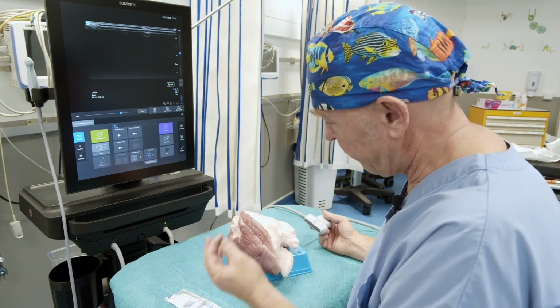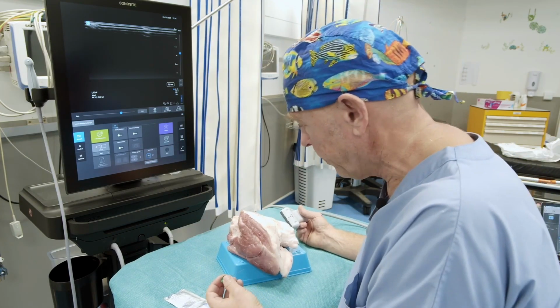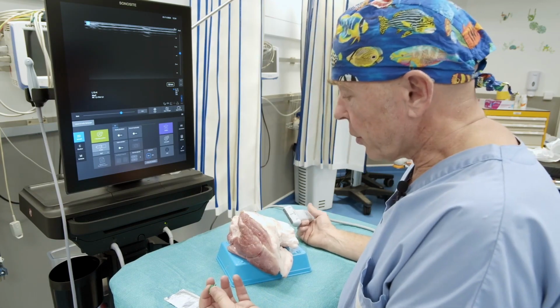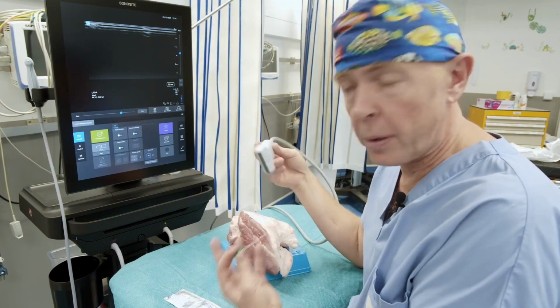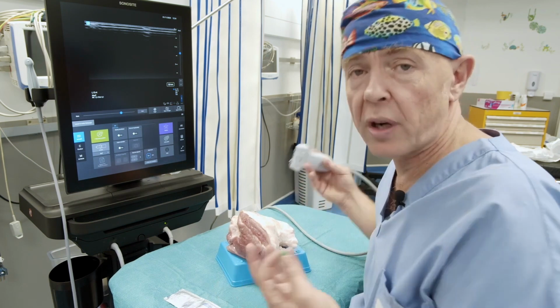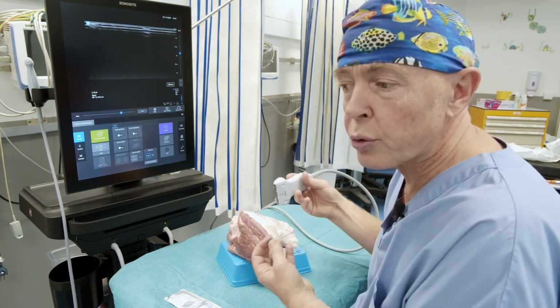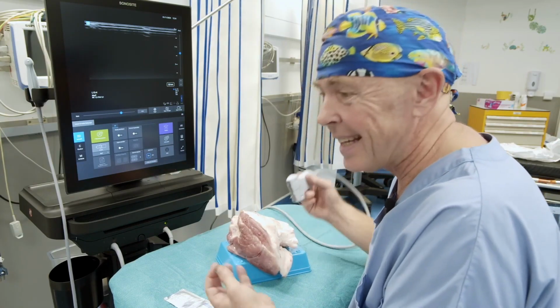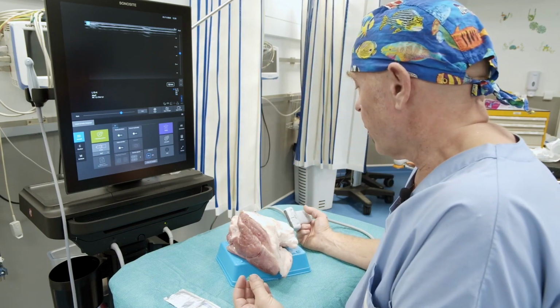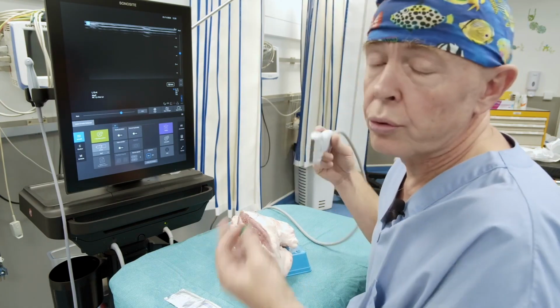Here I selected the end of a pork ham, but you could alternatively choose a small goat leg or even a turkey leg. So the 3 exercises you are able to perform are as follows. First, learning to puncture while maintaining control of the needle, which constitutes the initial exercise. The second exercise involves locating your needle when it has been misplaced, because in real-life scenarios, we are frequently very focused on our screen, and we might apply excessive pressure on the probe and the needle, which often results in losing the visualization of the needle. And subsequently, the third exercise entails modifying the orientation while sustaining visual control.